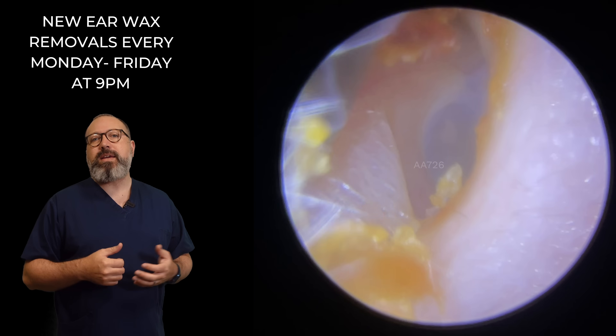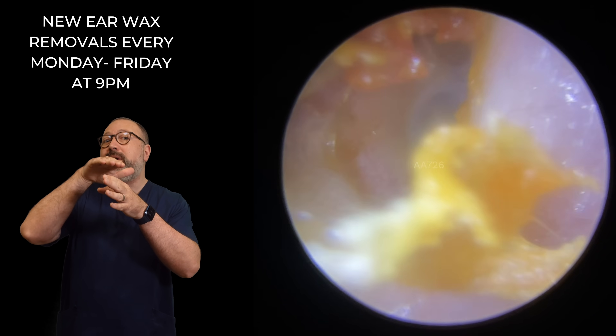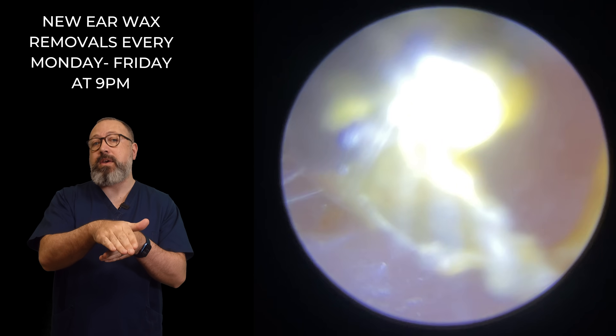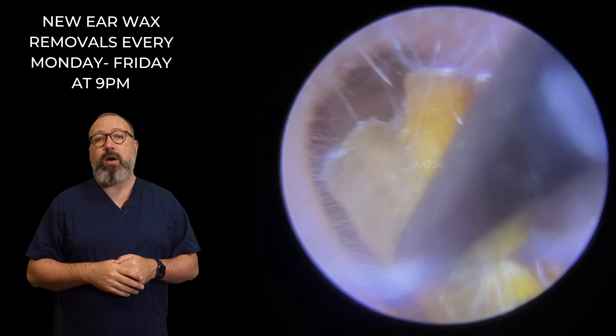So we're just taking this away. You can really see that layer of skin going all the way into that medial portion of the ear canal — quite deep in there as well.